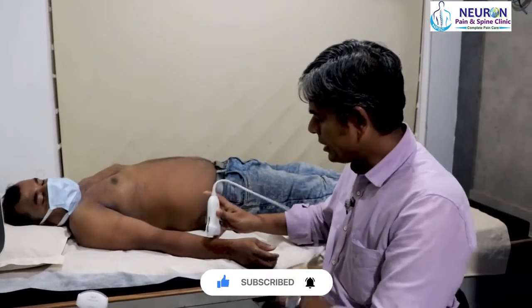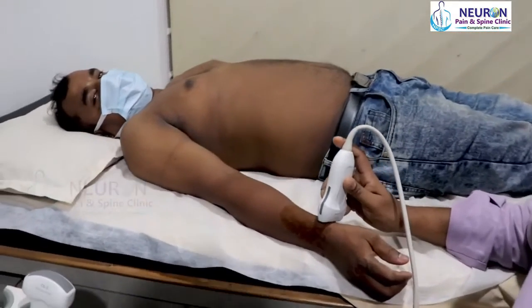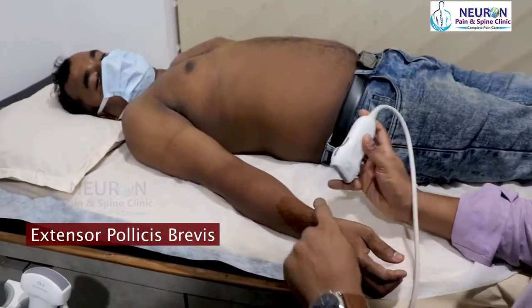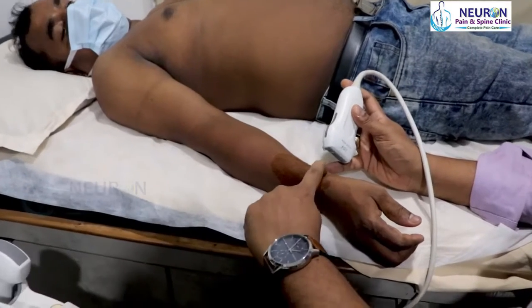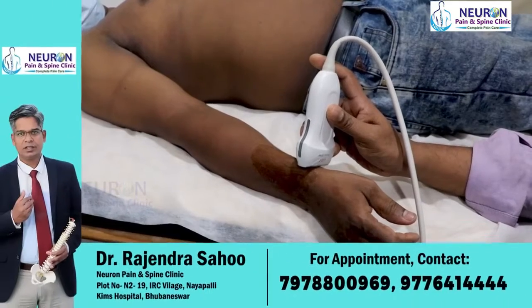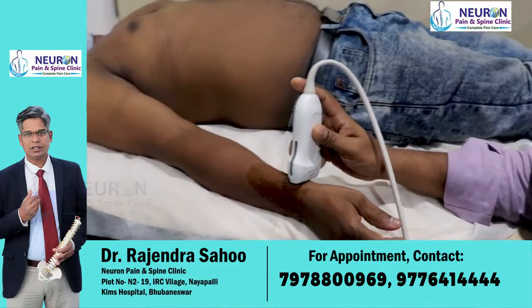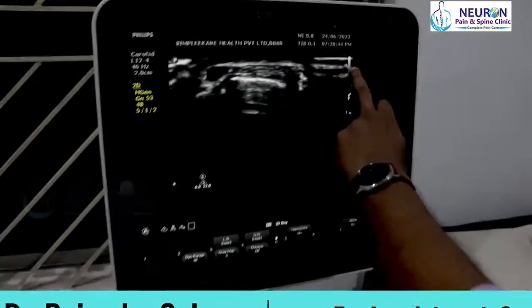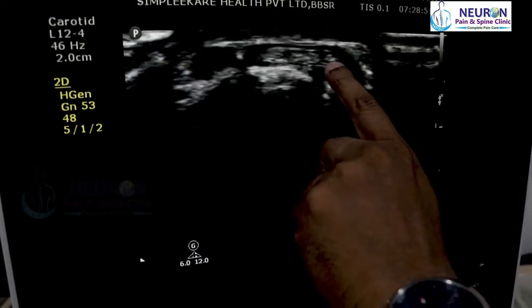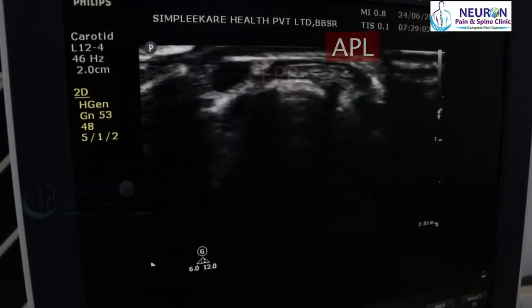I'm using a high frequency linear probe. Let us start with the first compartment, which is abductor pollicis longus and extensor pollicis brevis, located over the radial styloid. Once I place the probe there, the orientation marker on the screen points towards the dorsal side, so dorsal is on one side and ventral on the other. One can see the styloid of the radius, with two tendons on top of it — the bigger abductor pollicis longus and the smaller extensor pollicis brevis.